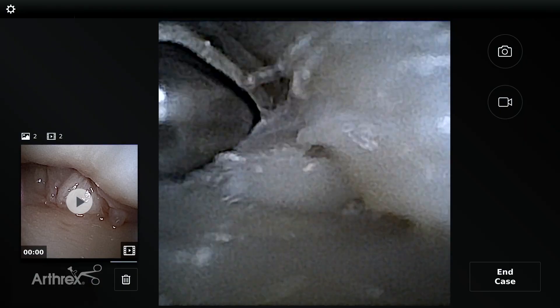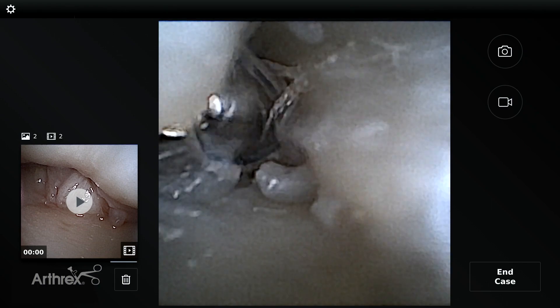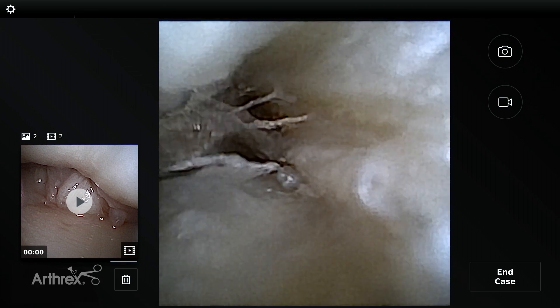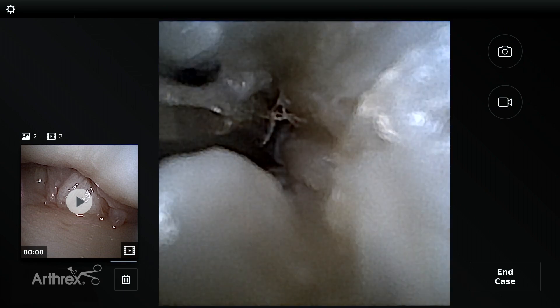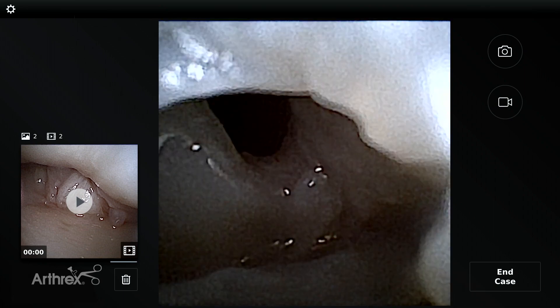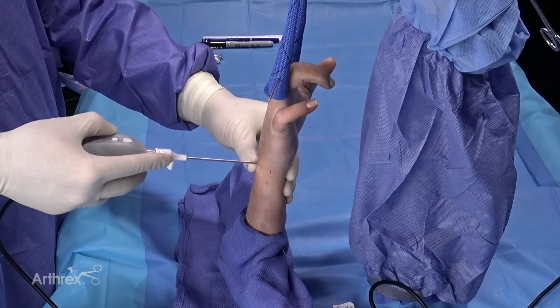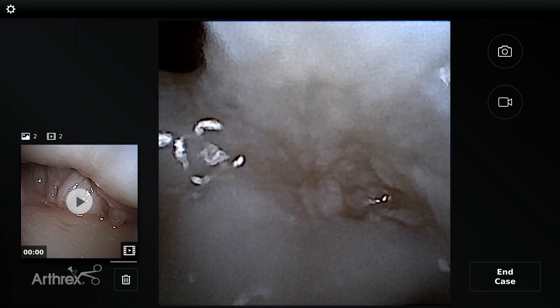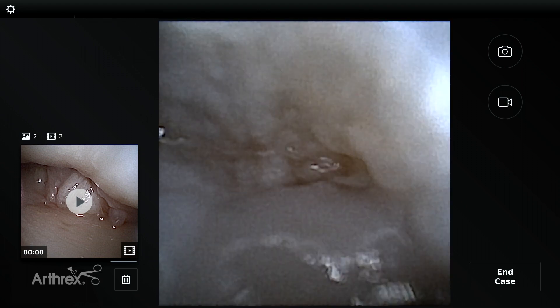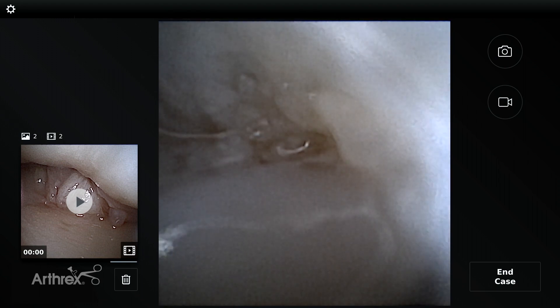Now in the DRUJ arthroscopy, we've taken the small joint shaver — the 1.9 — and you can see we're above the ulnar head, cleaning out some space underneath the TFCC. We want to see the foveal insertion to ensure it is stable. It's a tight space, but the nanoscope allows us to see in these tight spaces. We've now done our DRUJ arthroscopic synovectomy underneath the TFCC coming from radial. You can see the foveal insertion of the TFCC is intact, and you can see how the ulnar curtain essentially inserts into the fovea.